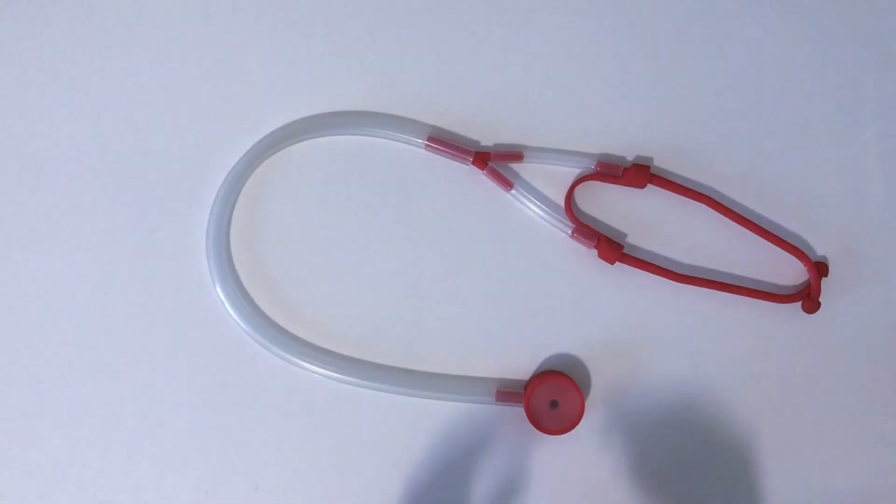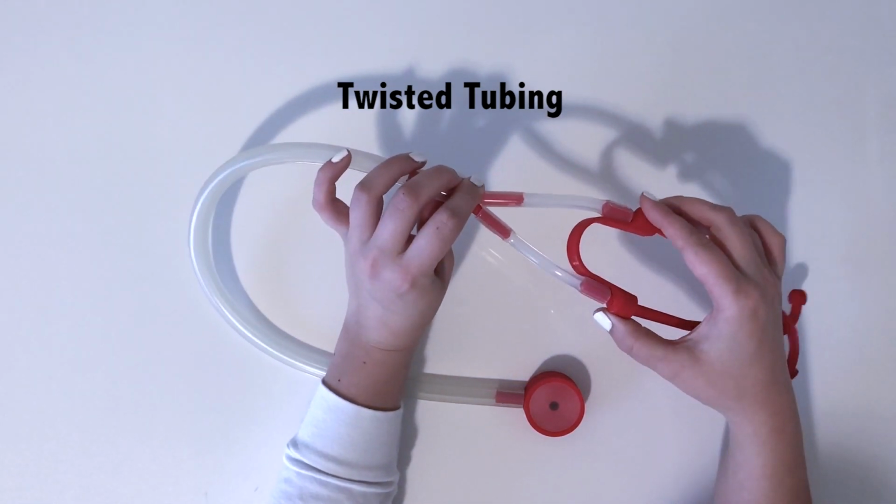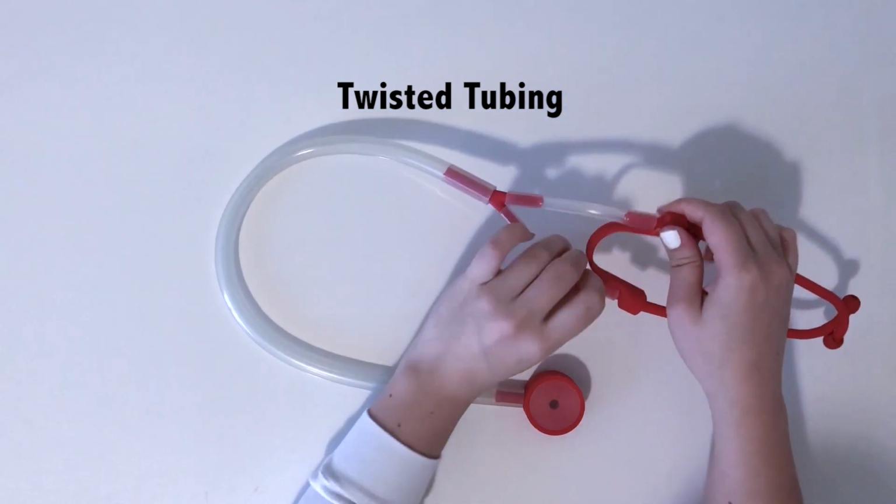Having trouble with your stethoscope? We will now go through the most common issues with stethoscope assembly that may affect the sound quality. Sometimes, the tubes can become twisted, which may affect the sound in one or both earpieces. Try straightening out the tubing and testing it again.